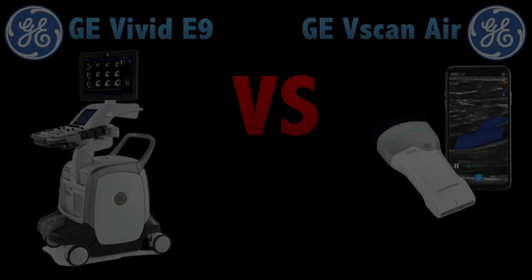We'll see a comparison between a cart machine, which is the GE Vivid E9, and a pocket device, which is the GE Vscan Air. But first, let me tell you a few comments.